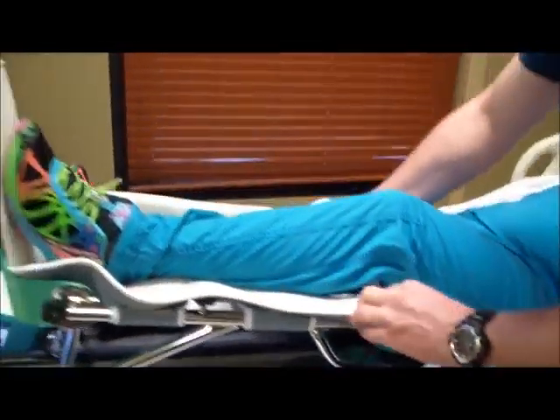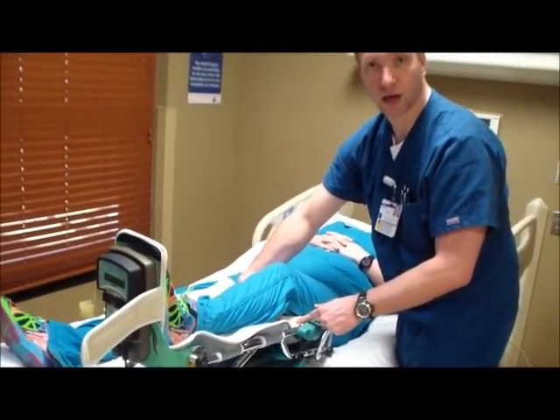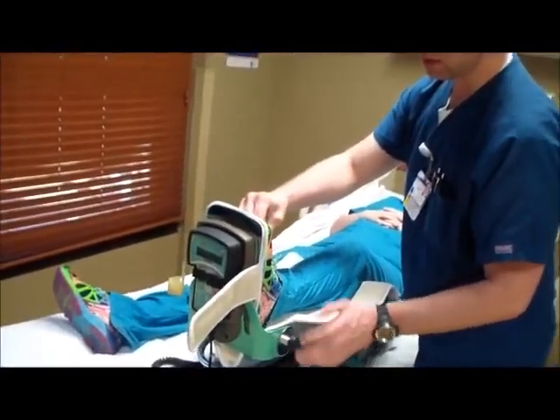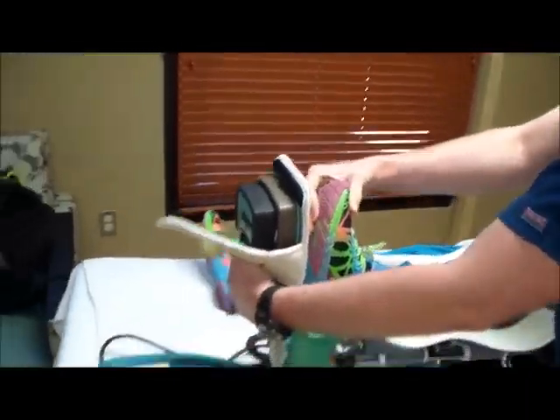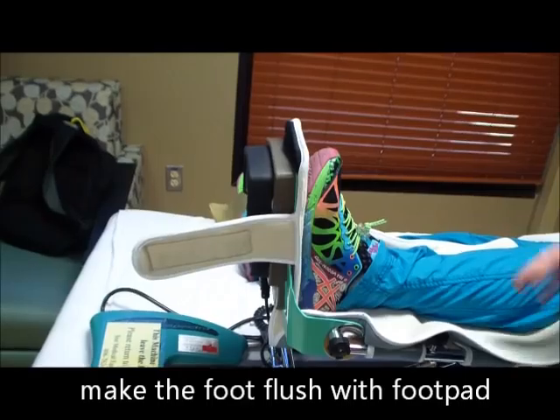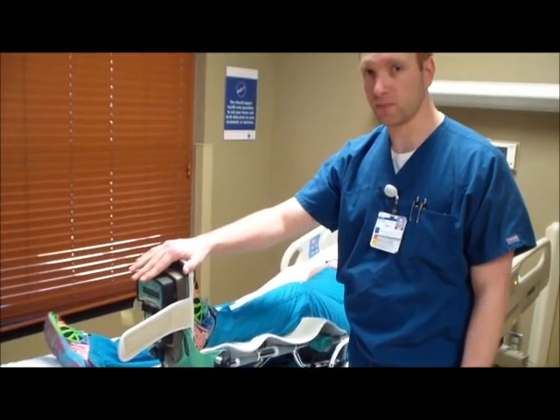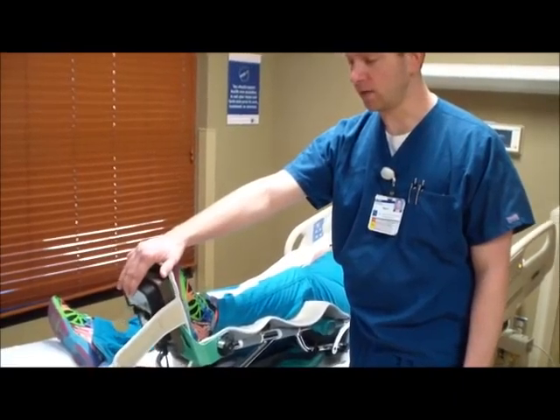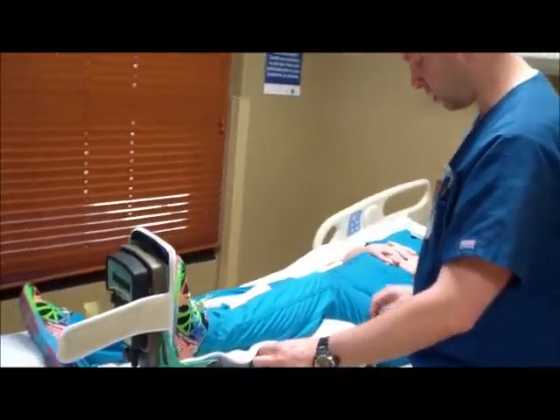Looks like we're good. So making sure that we're lined up with the patient's knee joint along with the axis of the CPM itself. With this as well, we want to make sure the length is abutted right up against the patient's foot. Everybody has a different style with the way they modify the ankle part. I like a neutral position. However, you have other therapists who like a slightly plantar flex aspect. Not very many people go with a dorsiflex position. So make sure everything's tight and secure.